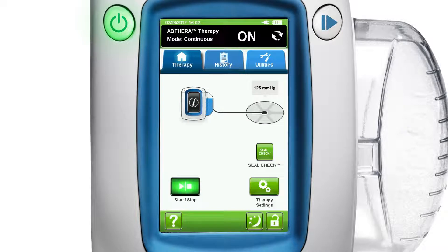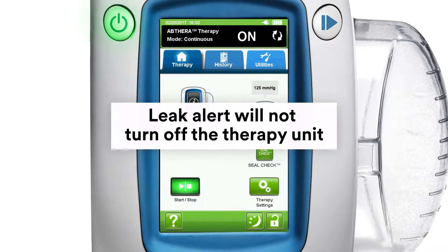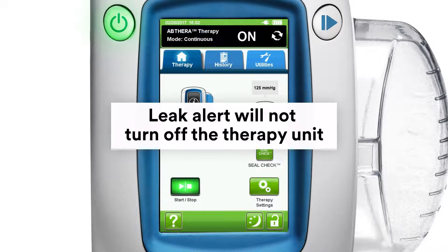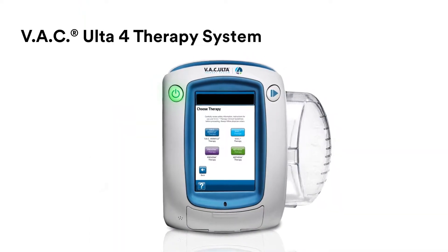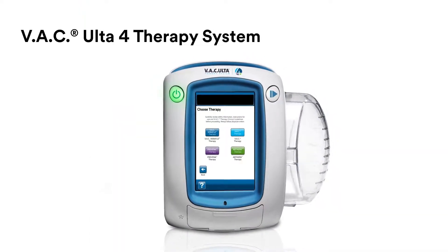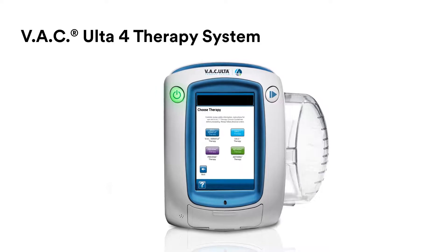It's important to note that, unlike other therapies, an Abthera therapy leak alert will not turn off the VAC Alta4 therapy unit. If the alert sounds, the unit will continue to apply negative pressure. The VAC Alta4 therapy system — one unit, four therapies. Technology made simple.